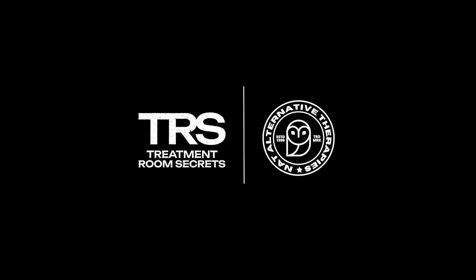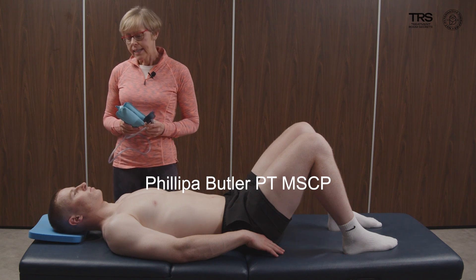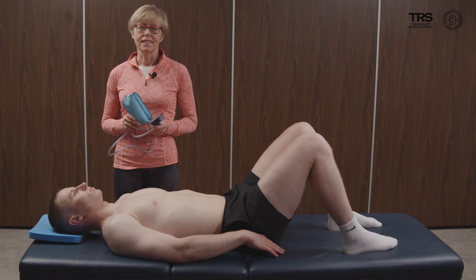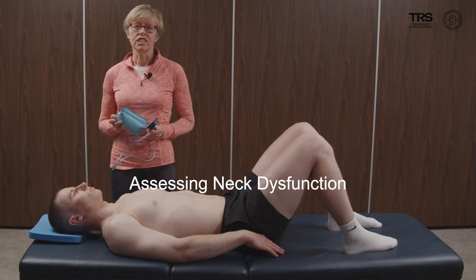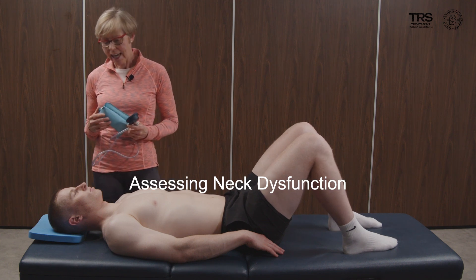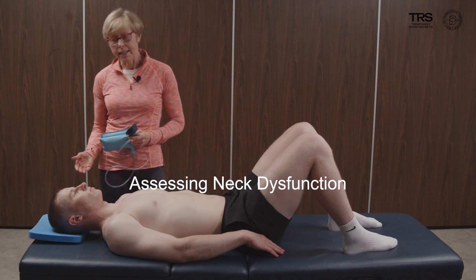We're going to use the pressure biofeedback cuff to evaluate the deep neck flexors and any corresponding increase in the sternocleidomastoid and the anterior scalenes. Neck dysfunction is very common and often goes unnoticed. So we bring Jack to lie on the couch to acquire this neutral neck position, which he's achieved quite easily.